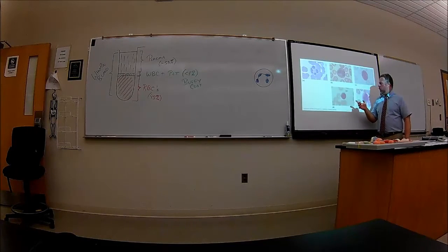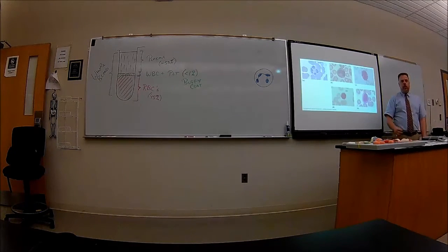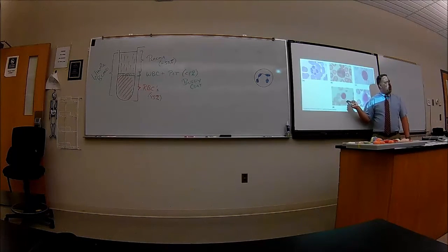Okay? Let's look at this one over here. So you say to yourself, is this white blood cell, is the nucleus lobed? No. So you narrow it down to how many? Two. You can bring a quarter in and flip it. You can bring that. It's not cheating. People wonder though. But yeah, you bring it down to two.